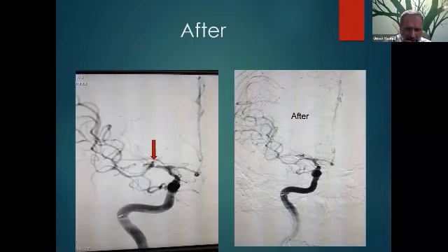So after these, there are some residuals we have to look for in one aneurysm. We didn't pack all the aneurysm that much. In a few cases this remained residual, but the more important thing is the safety of that patient. And we followed it up for 1 year or two, and the patient didn't turn up.